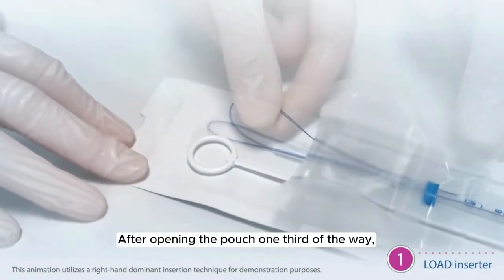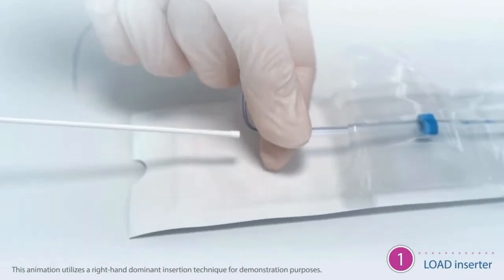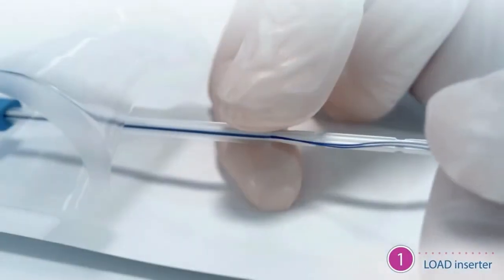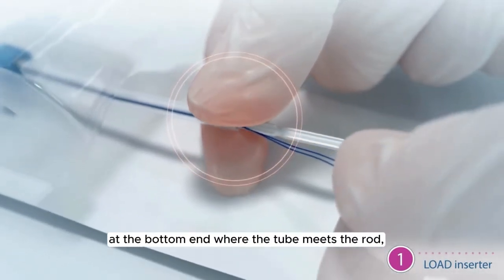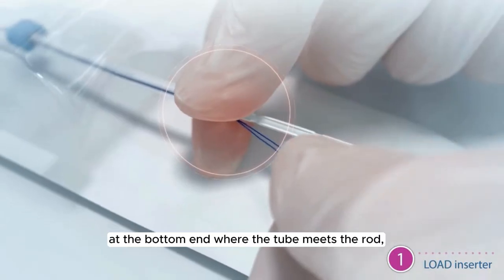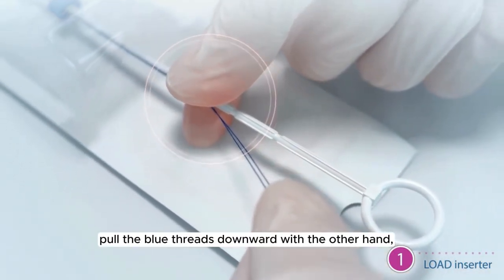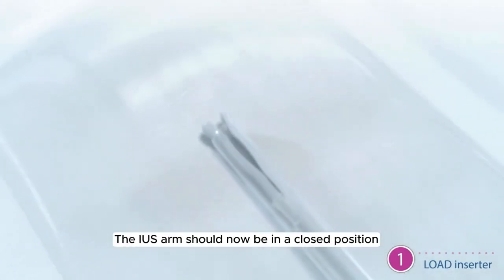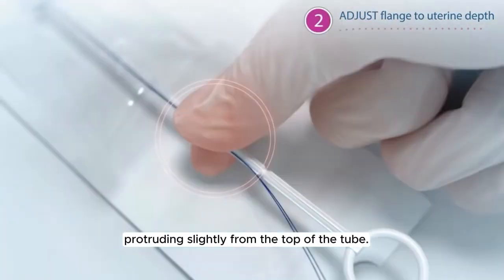After opening the pouch one-third of the way, release the threads from the flange and place the rod into the insertion tube. Holding the insertion tube and the rod firmly at the bottom end where the tube meets the rod, pull the blue threads downward with the other hand to draw the IUS into the tube. The IUS arm should now be in a closed position with the knobs protruding slightly from the top of the tube.